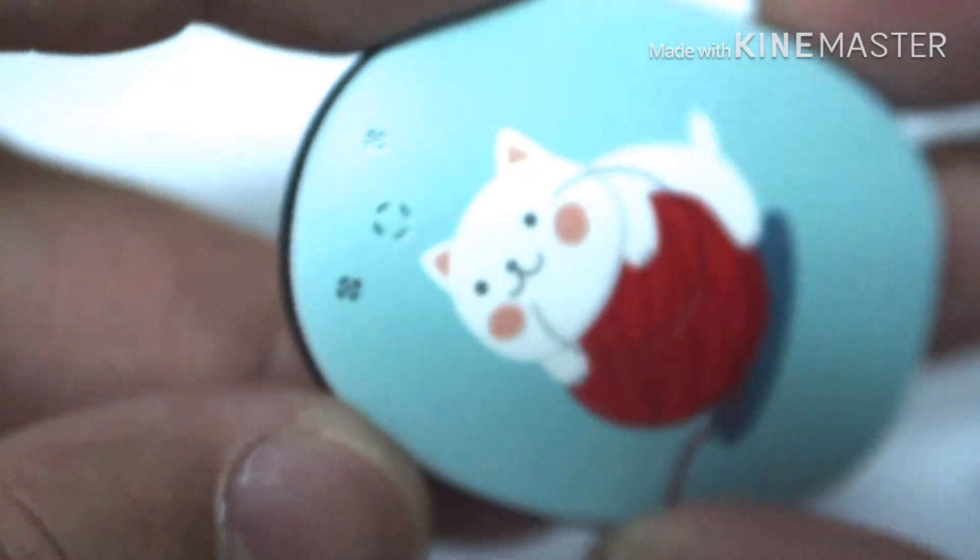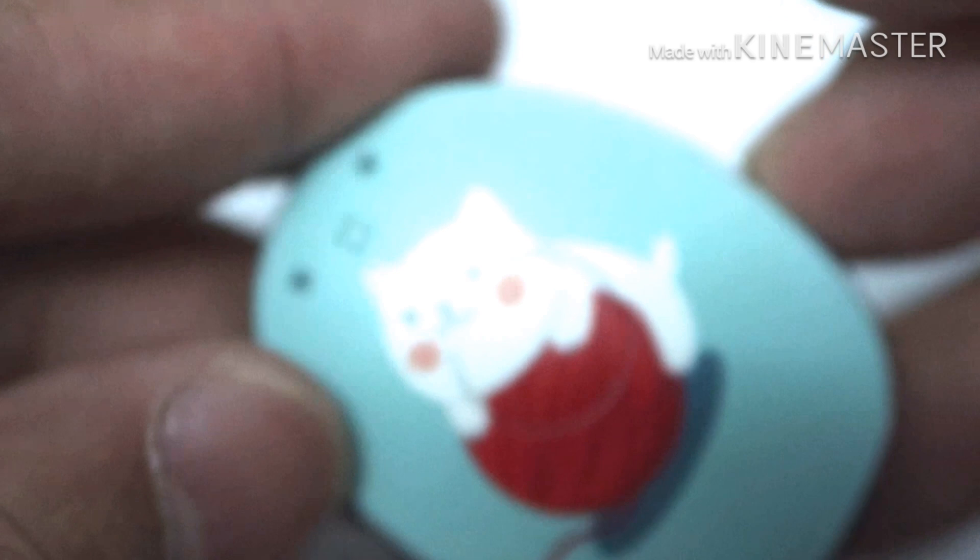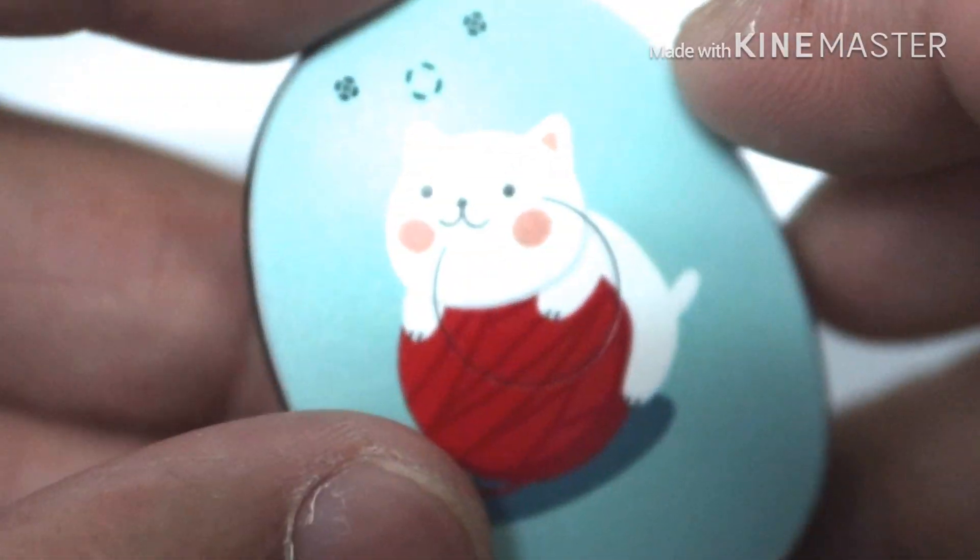Make sure that there's no gap. And voila! You're done!